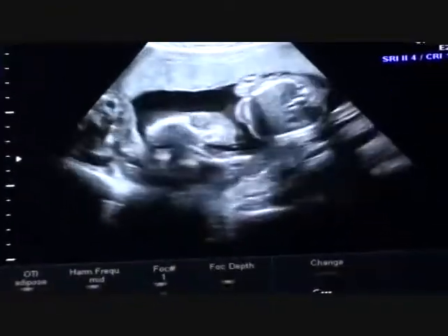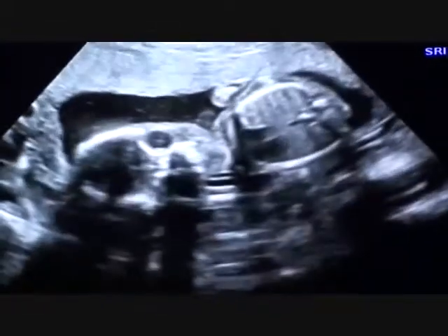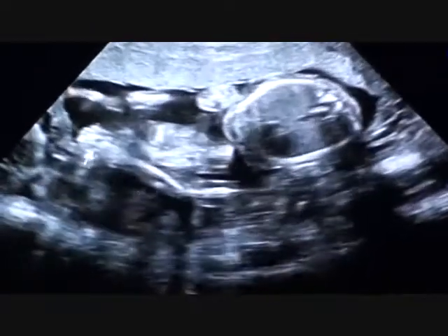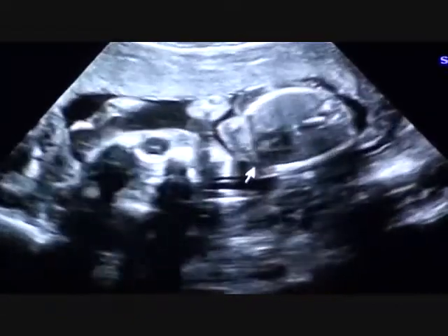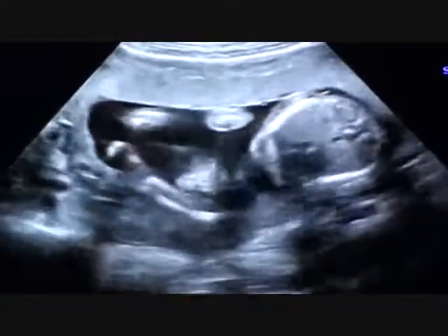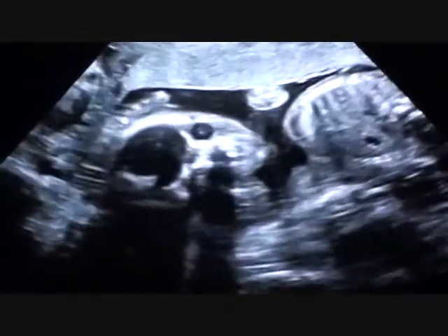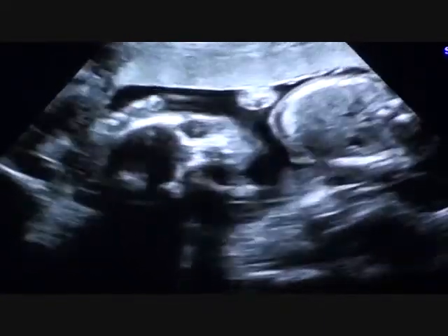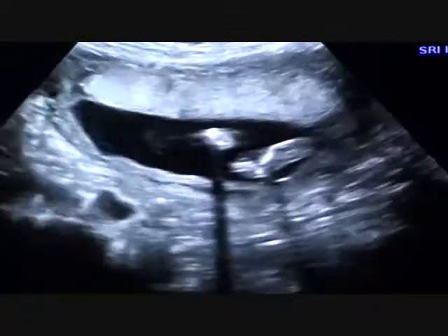All right, let's see. I'm going to come down here. Let's see a little bit of his face peeking back there. Little arms up, heart beating. That's the belly. Let's get that little hand out of my way — a little bit of a hand right there. You can see the extremities up there too. There's feet — one foot, another foot, two feet. Feet are up, head down.